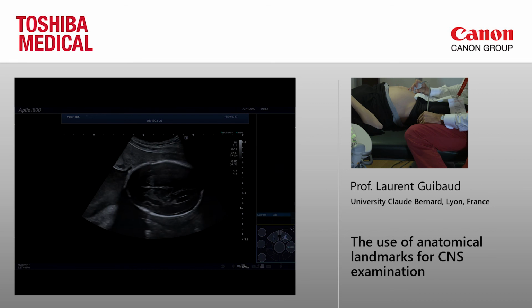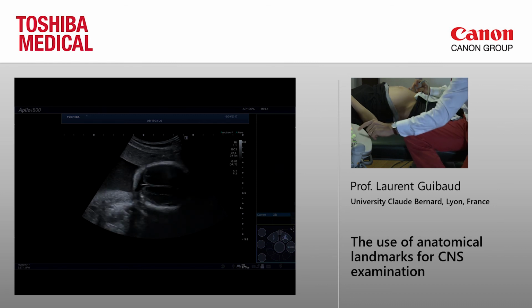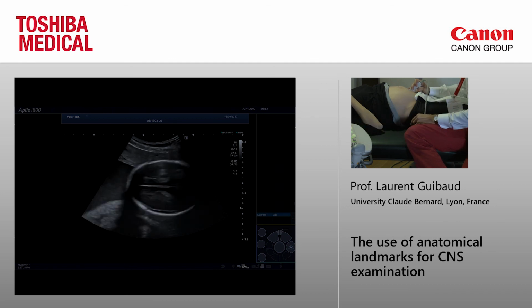Now we can go very far here. There is no sulcus, and this is the central sulcus, which appears around 26 weeks, and we are at 23. There is a smooth cortex at this level, which is completely normal.